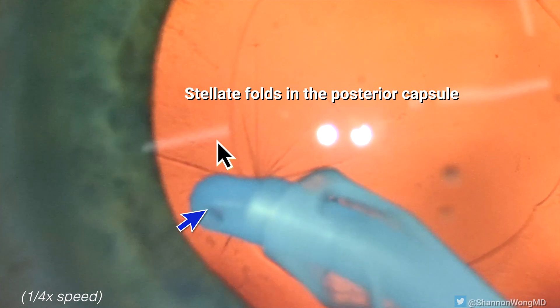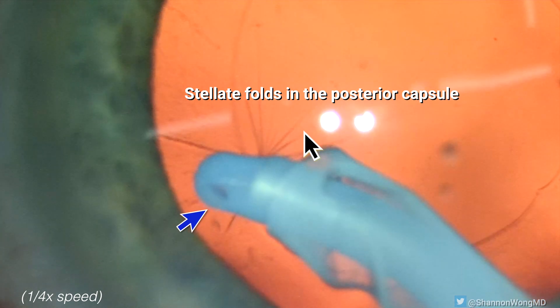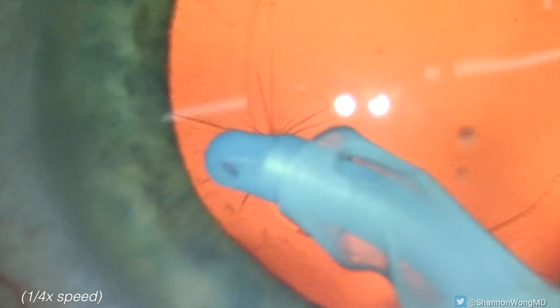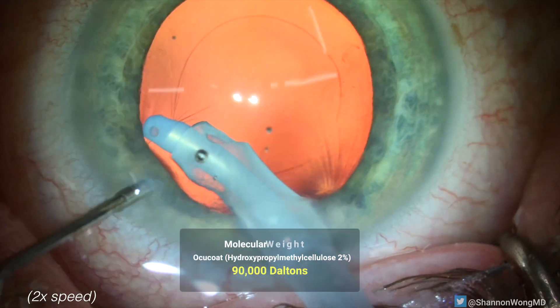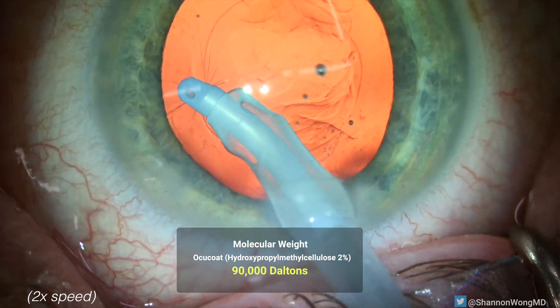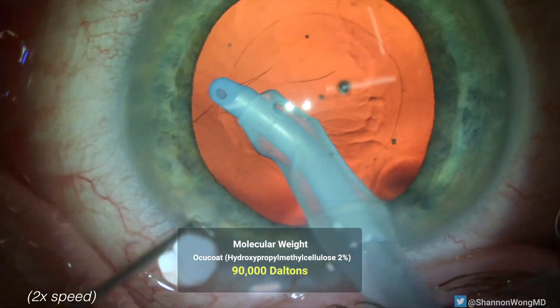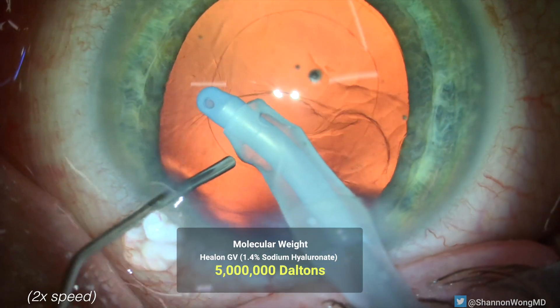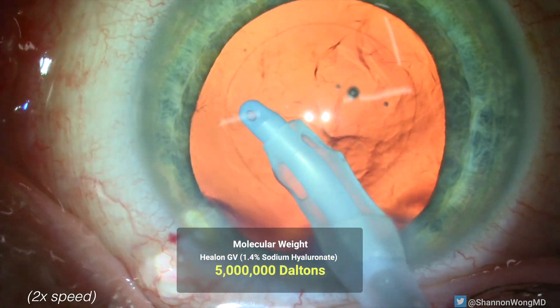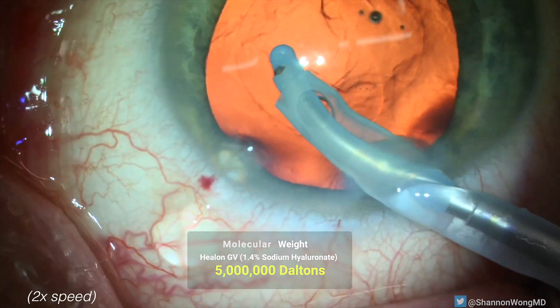But we always pay attention to detail, so we stop and instill some OcuCoat to try to visco-dissect the posterior capsule from the back surface of the IA tip. OcuCoat does not achieve the desired result. Then we instill Healon GV, a heavier molecular weight viscoelastic, which successfully liberates the incarcerated posterior capsule from the back side of the silicone tip IA.